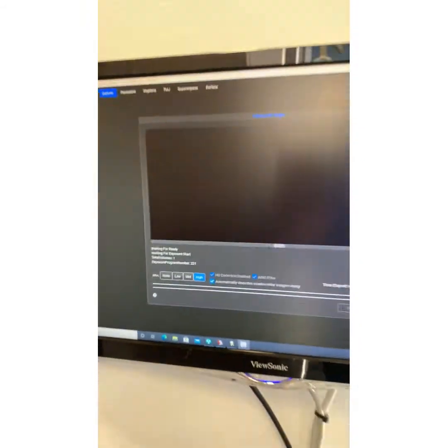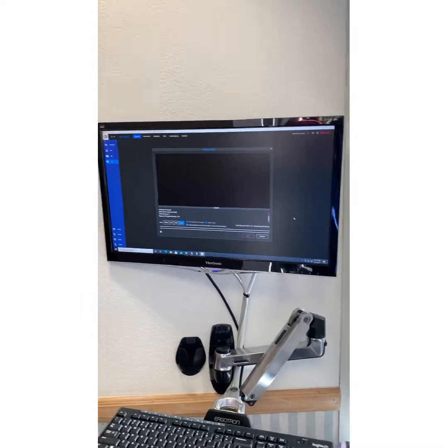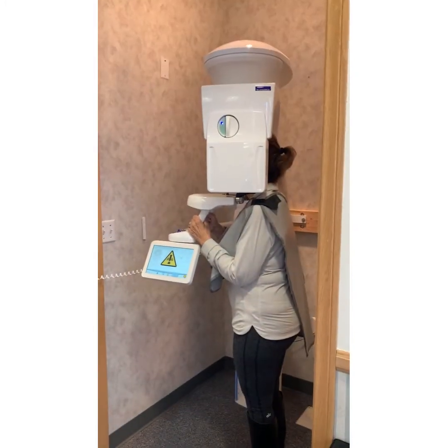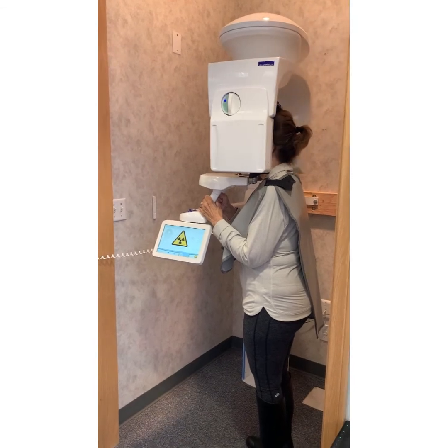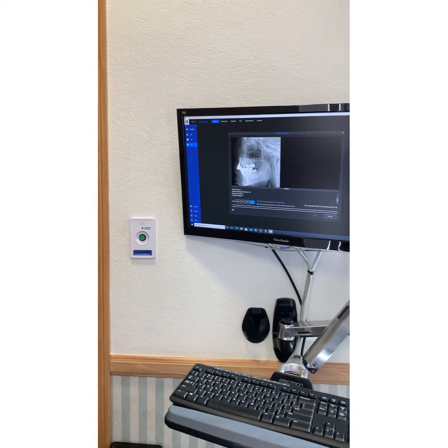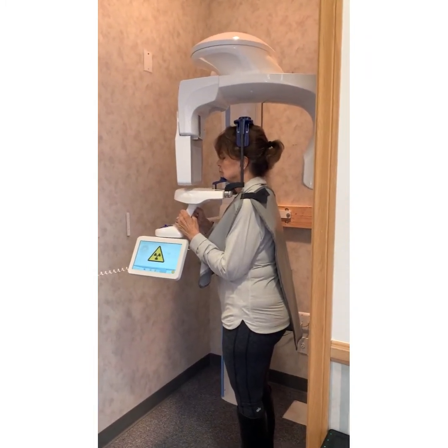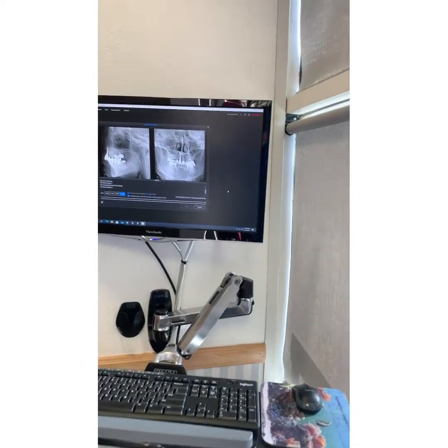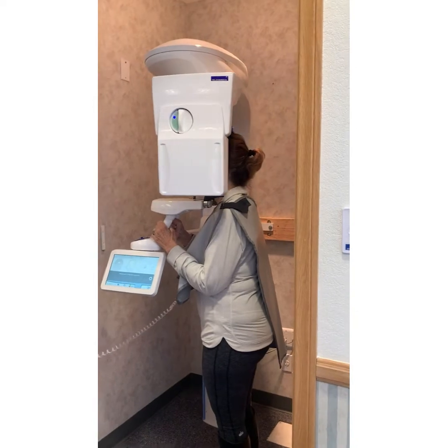All right, everybody, ready? You're going to press and hold, and this is just going to take a quick little dip. Press and hold. Yep, and then once you hear it, then you count to 3, then you release. You release now. Now for this, you come over here and just make sure that everything is good to go.